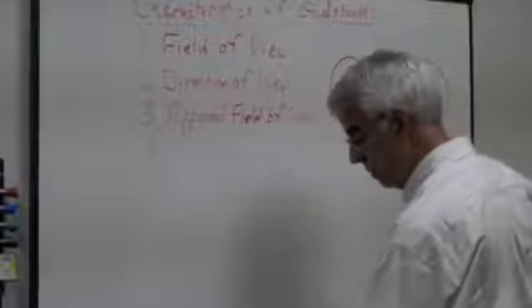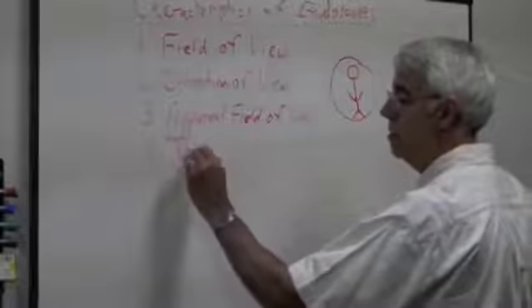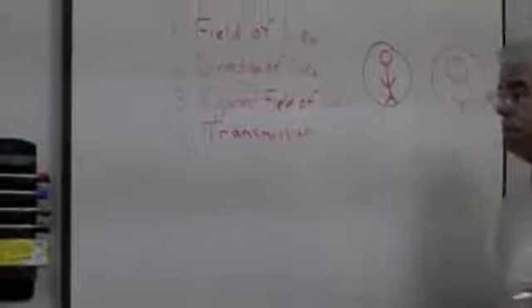The next value that's really important is the transmission. Now we're getting to something that, yeah, the more the merrier.